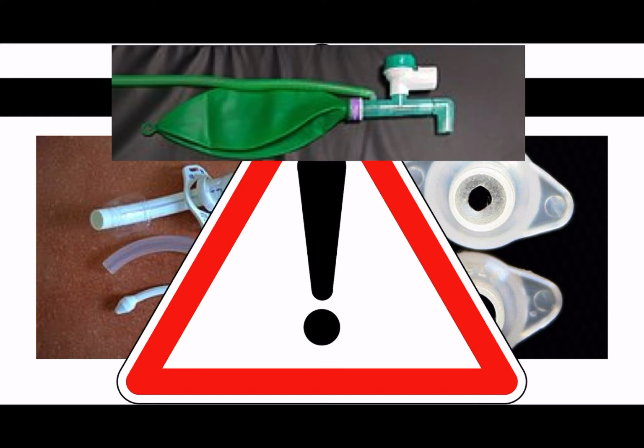Now, the important thing about tracheostomies with inner cannulas is that this mechanism, this 15mm connector, only fits onto the tracheostomy if you have the inner cannula in.